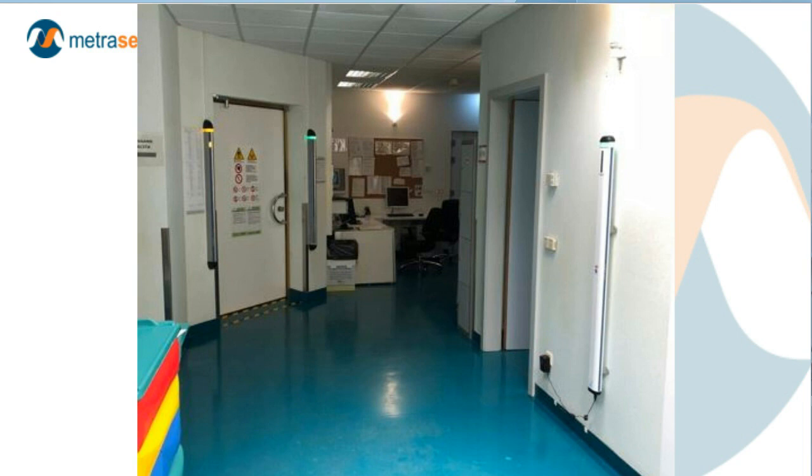That you use the screener, the object on the right, typically located in a zone 2 area, adjacent to patient changing areas and patient lockers, where you double check and make sure that when you ask them to change or empty their pockets or whatever, that they've actually complied with that in the location where it's easy to make any corrections. The second step in this, and actually the one that is most commonly deployed when a site deploys just one, is the version on the left, the doorway protection systems.